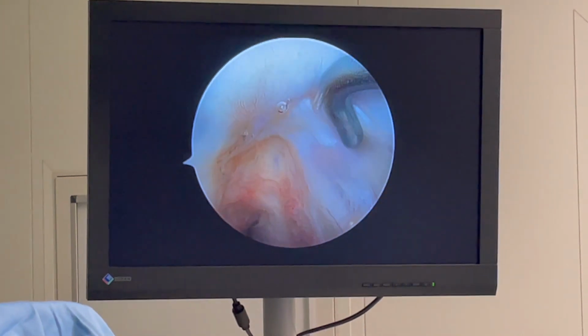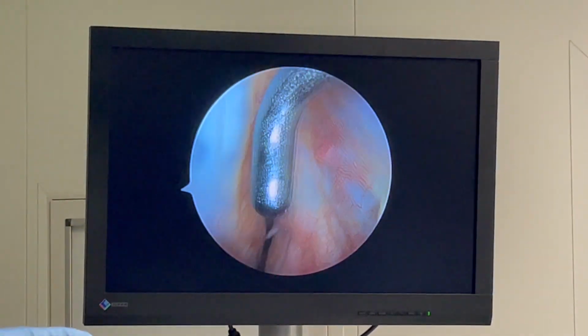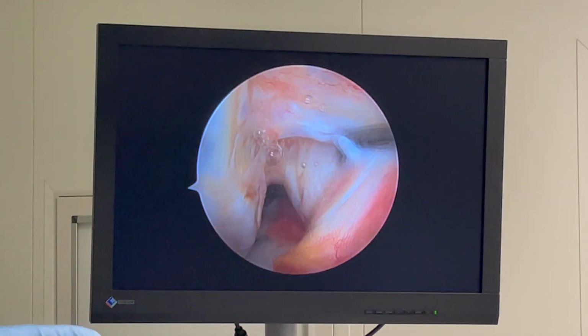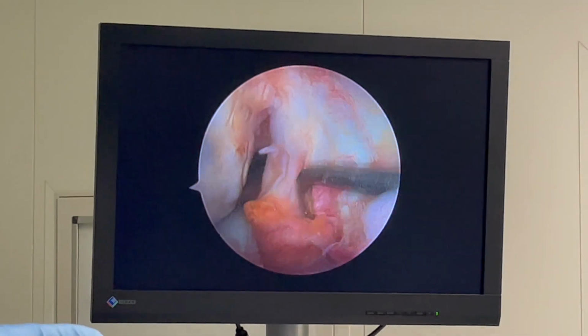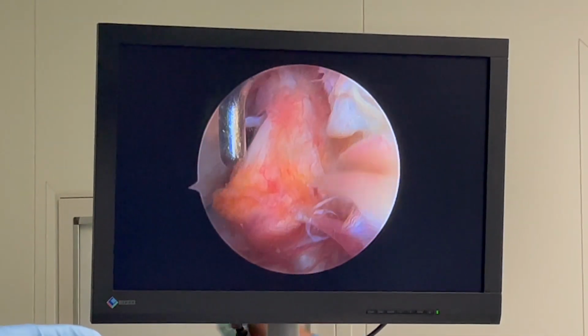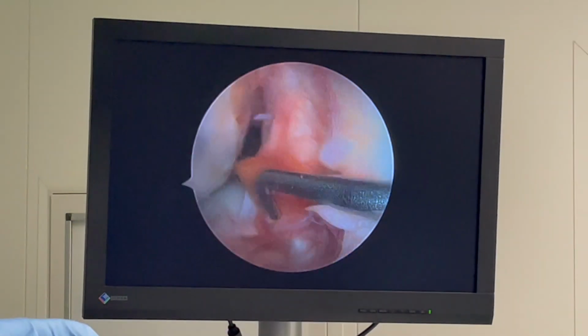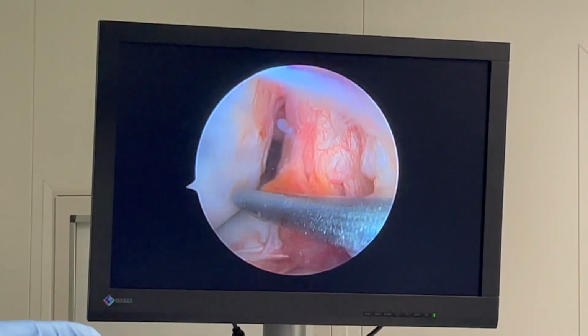Hoffa's ligament, right? This is a fat pad, right? So this is where the ACL should have been, right? So this is the ACL stump. Mohammed, can you see the screen? Yeah, this is the broken ACL. Okay, so it is not there.